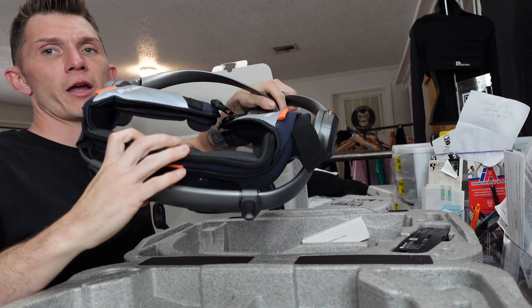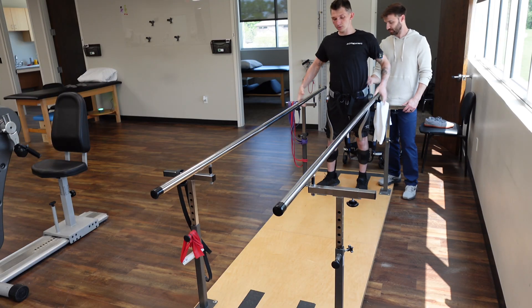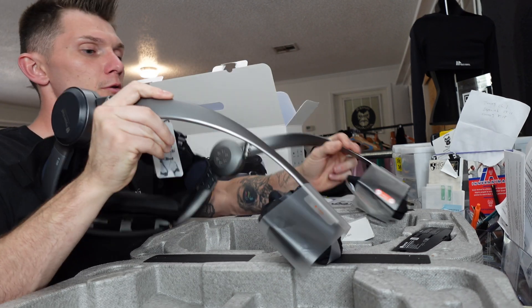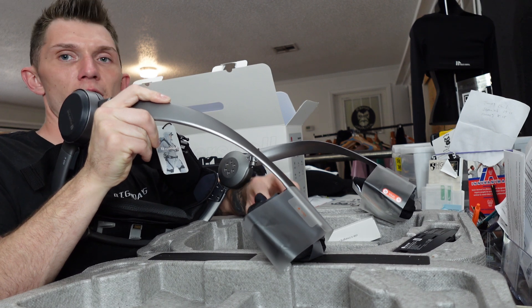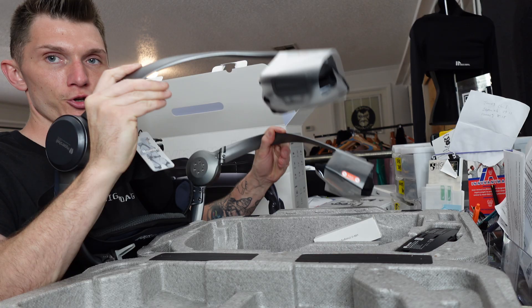This is going to go around my hips — this is going to be my low back area. That's going to wrap around the front. Lock them out. And then these little things are going to go closer to my thigh, each one. And in theory, it's going to help with this motion.